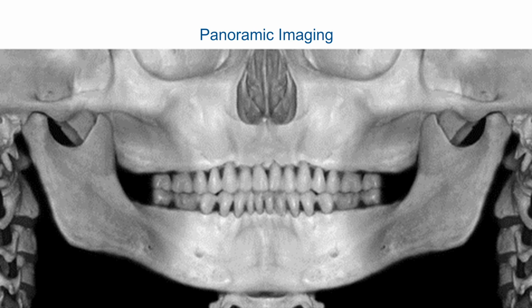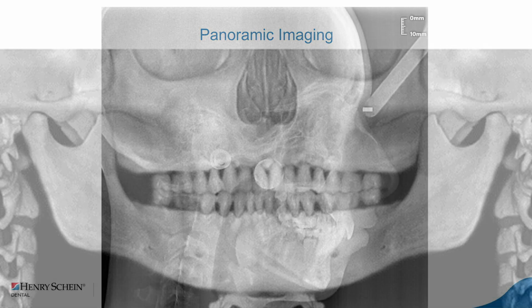You have so much overimposition that sometimes it's very difficult to assess. For supernumerary teeth, for example, in that area, sometimes it's almost impossible to see them on a pan, especially if the patient is also malpositioned and you have overimposition of the hard palate over the apical area of your maxillary teeth. So there's a lot of distortion and a lot of overimposition.